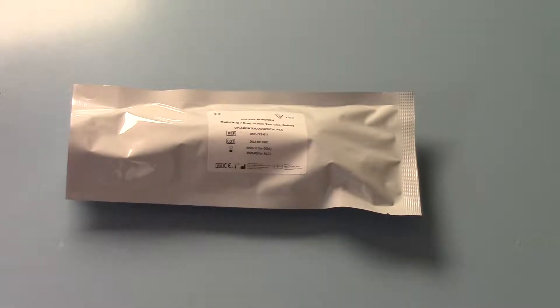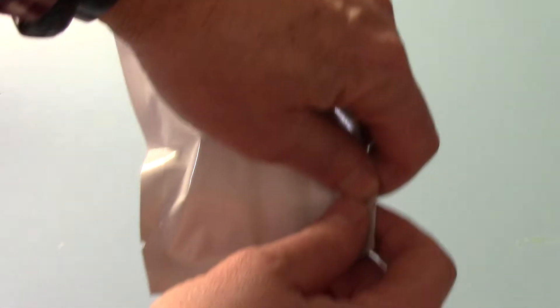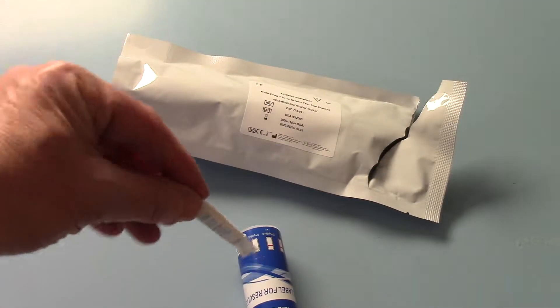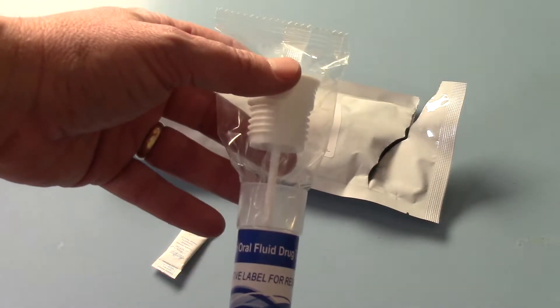This is part two of the Novex 7-in-1 saliva barrel test demonstration. Here we have one of the foils which I'm going to open for you now to show you the test. When you're ready to perform the test you open this up and inside you have, first thing to explain, a little bag of desiccant which is what keeps it dry and absorbs any moisture that may have been packed in with the foil.